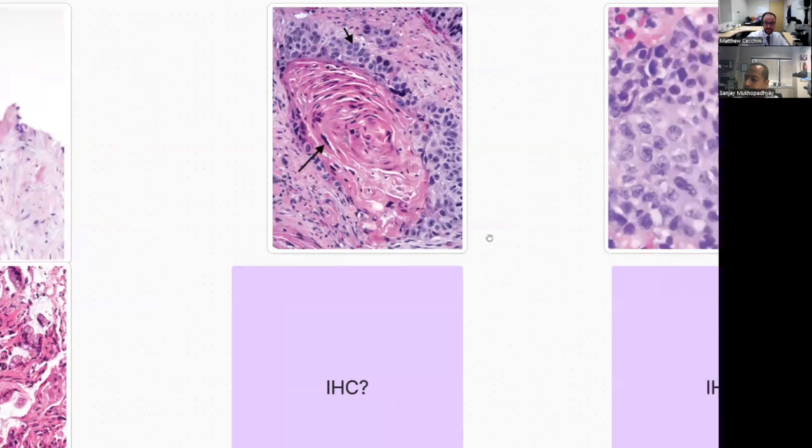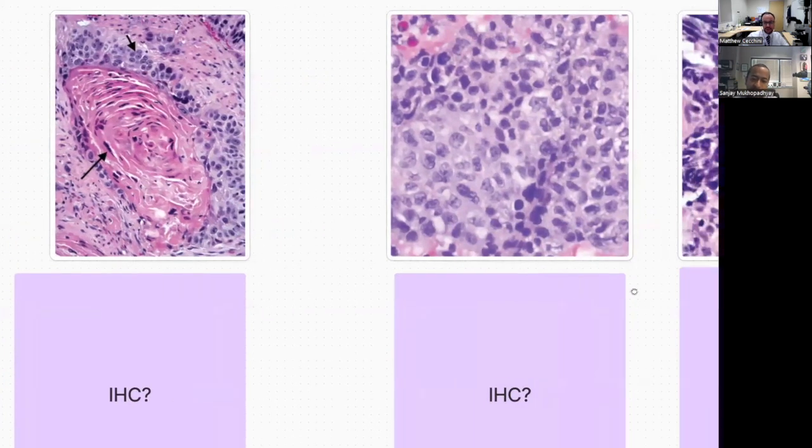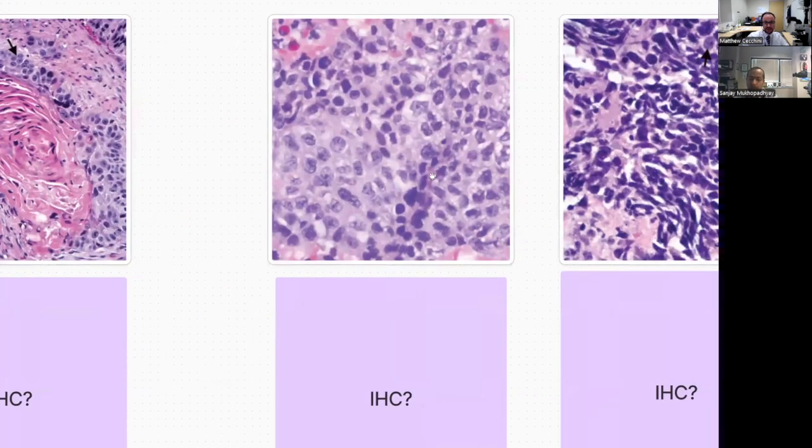That's primary lung squamous, great. Okay, so what about this scenario where we don't have clear glandular differentiation or squamous differentiation, and we're in a non-small cell NOS type of category on a small biopsy? What do you think is the best reason to do immunohistochemistry? So this is the setting where immunohistochemistry I think is most helpful, in what appears to be a lung cancer. Here I do TTF1 and P40. I think that is enough to subtype most of these cases.